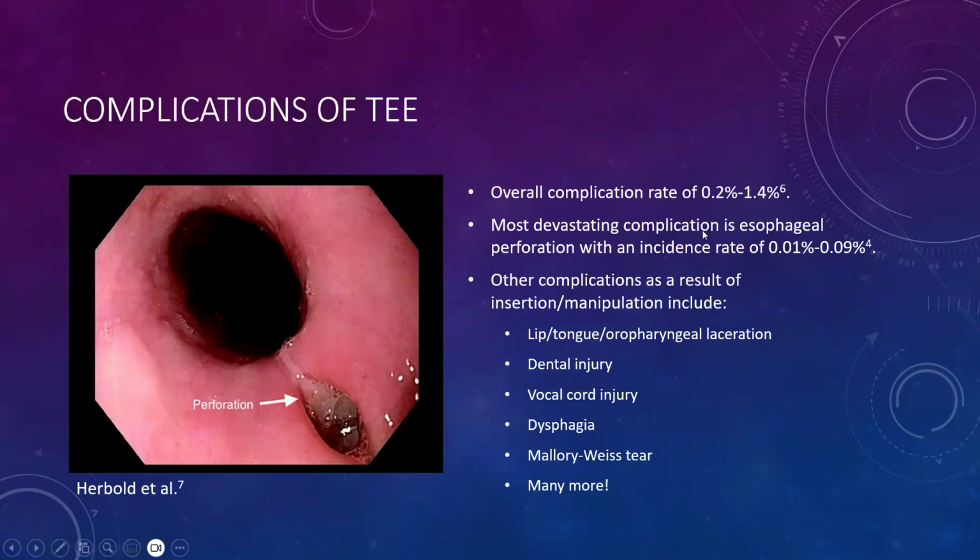I think, similar to me, most of the times that you guys are dropping probes in people, they either have no mental status or are already intubated and sedated. Obviously, there are exceptions, but my guess is that most of the time you're doing this in someone who's not going to be fighting you too much.